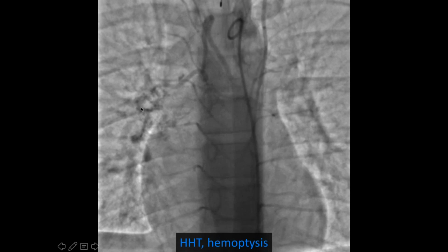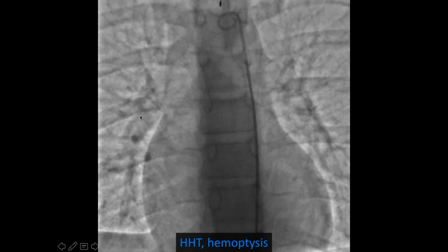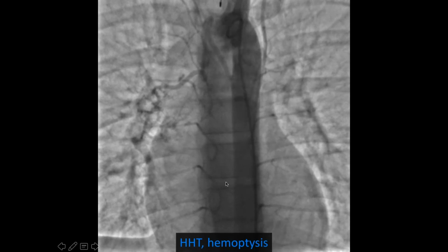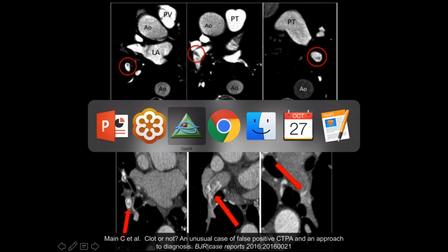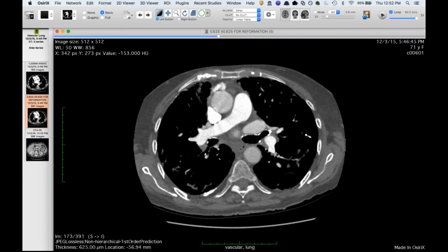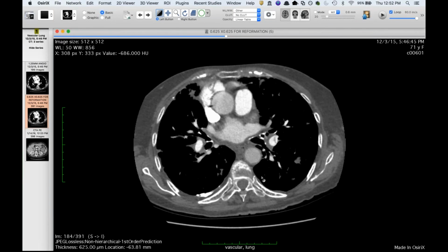This was a patient with HHT and had, hopefully the video is showing up, a spontaneous one, or related to his HHT, I don't know. You can see on this bronchial artery angiogram, you'll see filling of the right lower lobe pulmonary artery here through this connection. You can see it start to opacify. I don't have any good one in the setting of bronchiectasis, but the point is, in these cases, I think that's one of the contributing factors for causing this, and it's right in that same area. You can see there's a little bit of contrast in this bronchial artery, and that's not the exact one that anastomoses with that pulmonary artery right there, but that's definitely a contributing factor, like that case report I just showed you.